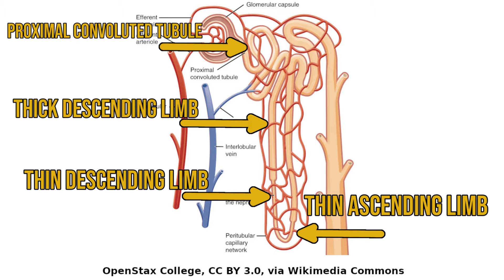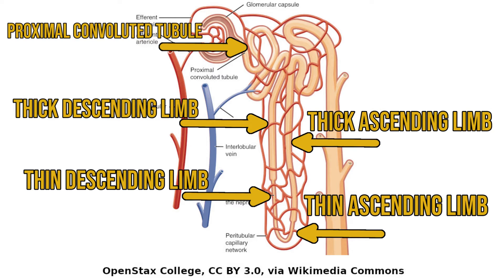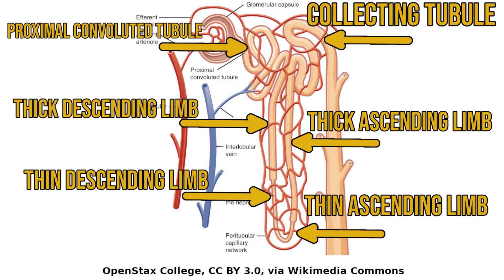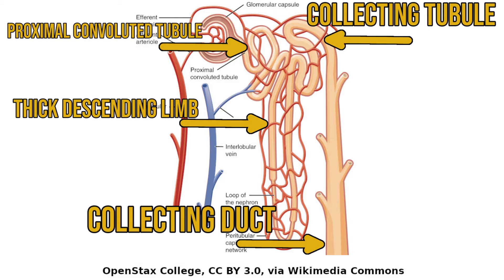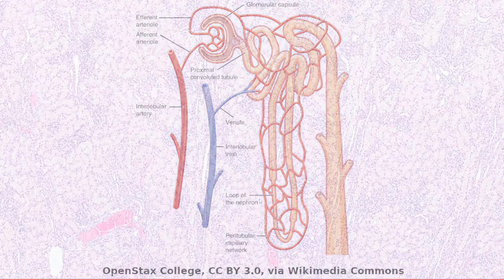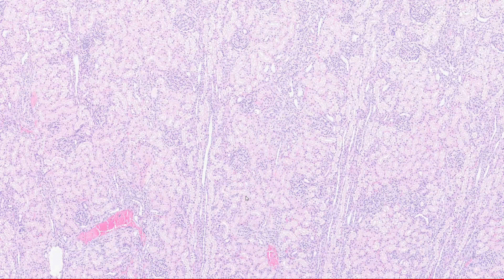Although the thin descending and thin ascending limbs have different names, histologically they look very similar, so we won't be able to tell them apart, but we'll be able to distinguish thin from thick limbs. The thin ascending limb then becomes the thick ascending limb, which connects to the distal convoluted tubule and has a very similar histologic appearance. The last two tubes are the collecting tubule and the collecting duct, which is a coalescence of collecting tubules that empties into the renal pelvis. Now let's go and find all of those structures histologically.